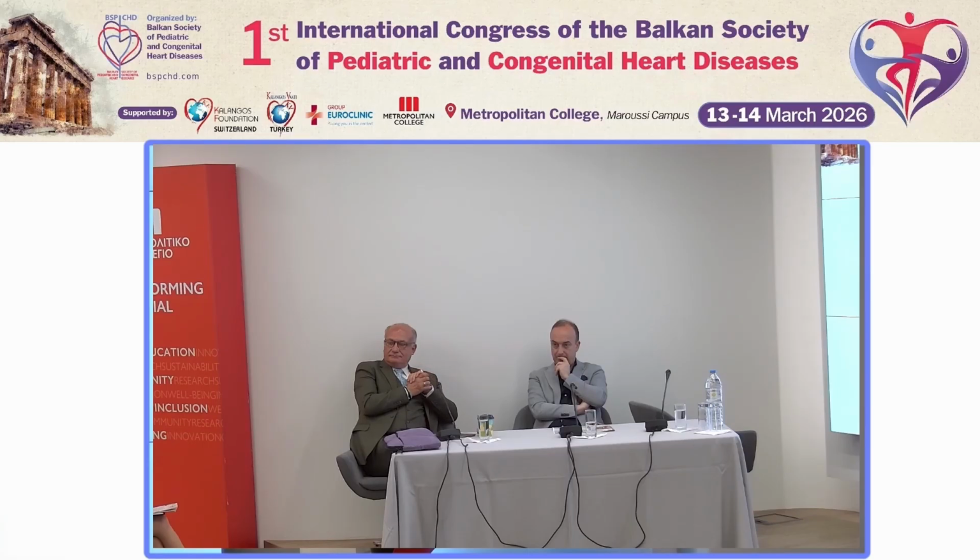And what can we treat? How can we treat? Sometimes the morphology is so complex that there is a very high risk of valve replacement. So then you can wait. You can probably even exceed the 45% regurgitation as long as you know that the LV function is well preserved. So the beauty of the imaging is that it's rapidly developing. We have the AI. I don't have time to talk about the AI, but certainly it is the future. And we have the option of imaging fusion. This is the future of cardiovascular imaging.